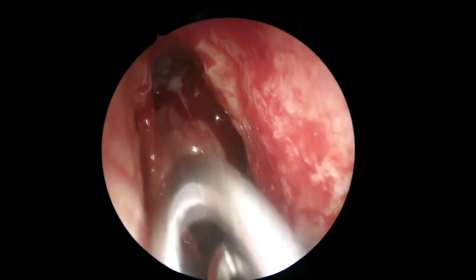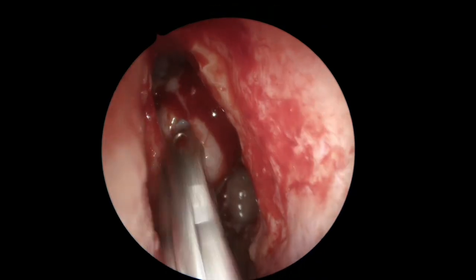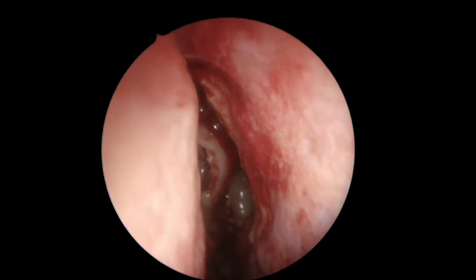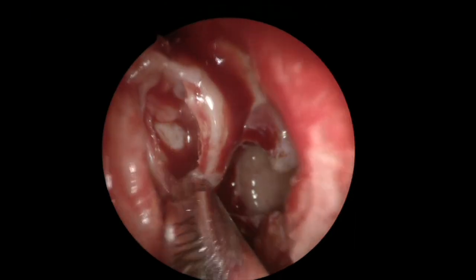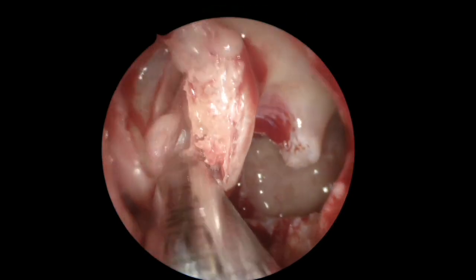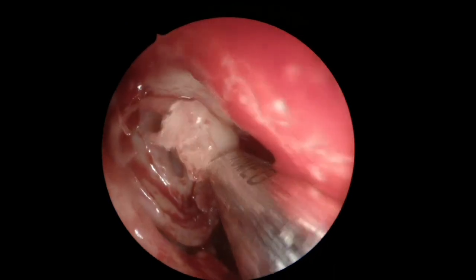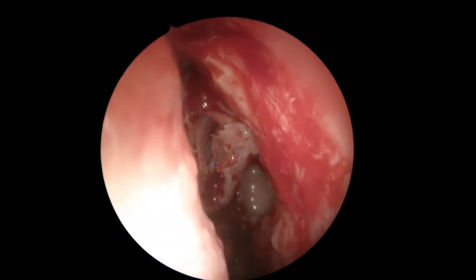We've opened the frontal sinus and the maxillary sinus, and now we're going to open the bulla and enter the anterior ethmoid complex. What I normally do is use two or three bites to open the anterior wall of the bulla at the most medial and inferior part — that's the safe place to open it. After that, I enter with the debrider again to remove all the mucosa. Remember that sinus surgery dissection is a bone surgery — what you're aiming for is the bone that you have to remove to advance.